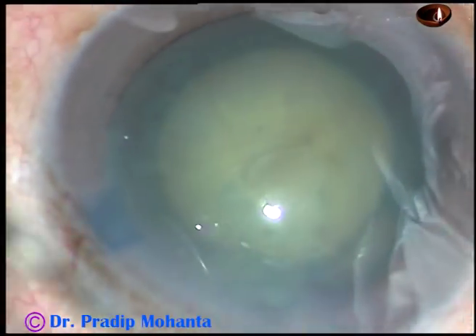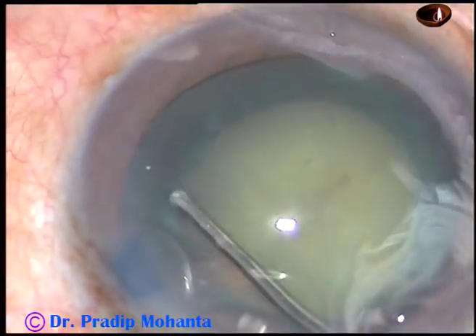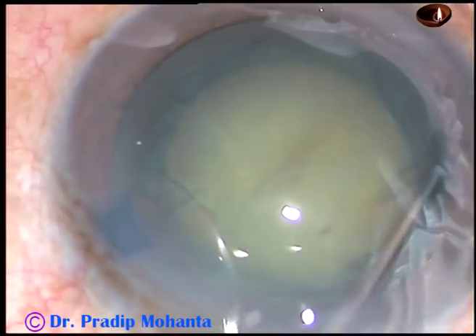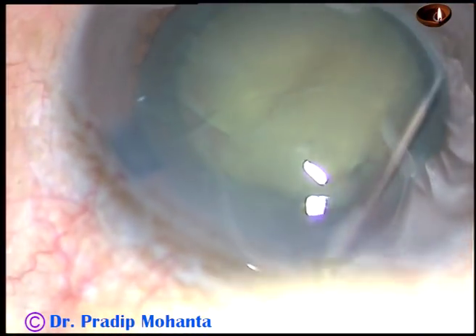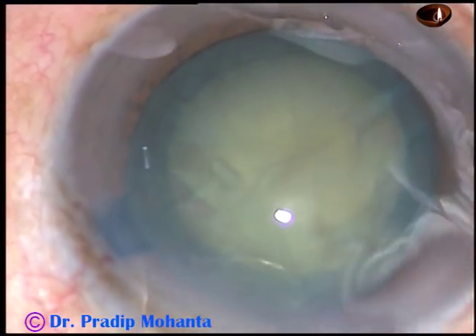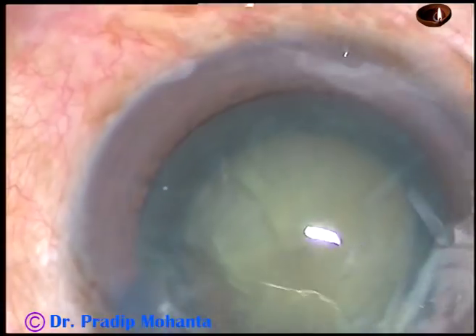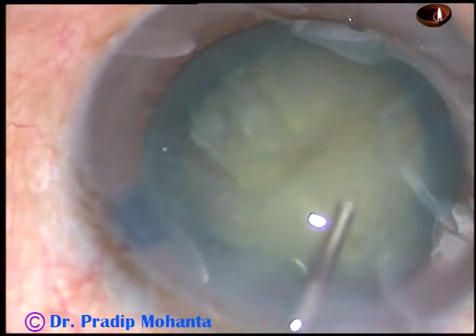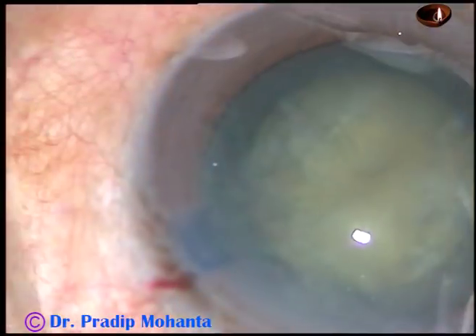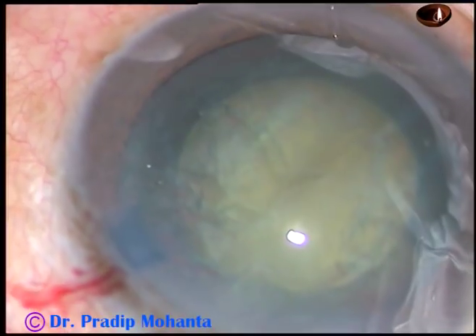The size is ideal — about 5.25 mm — and now I am trying to do hydrodissection. See how many attempts I am making: first, second, third attempt. Enough fluid is being injected — fourth, fifth attempt. Now I am sweeping, injecting, and depressing the capsule and nucleus. Even then, the nucleus did not rotate. I could not separate the cortex from the capsule.